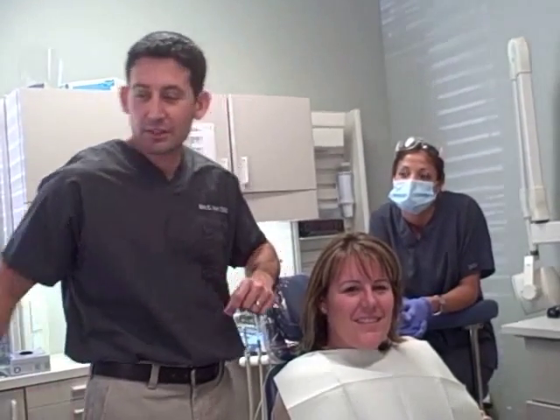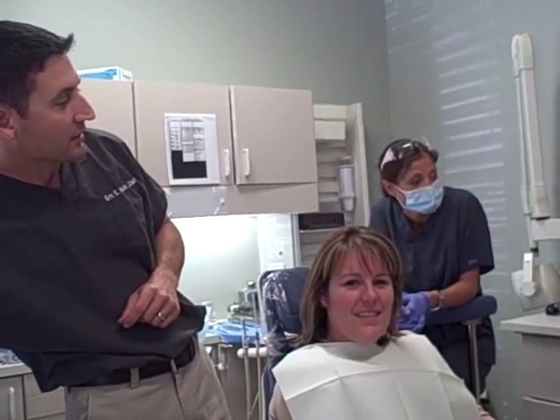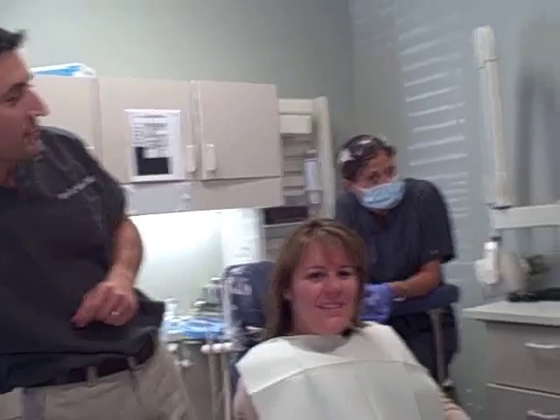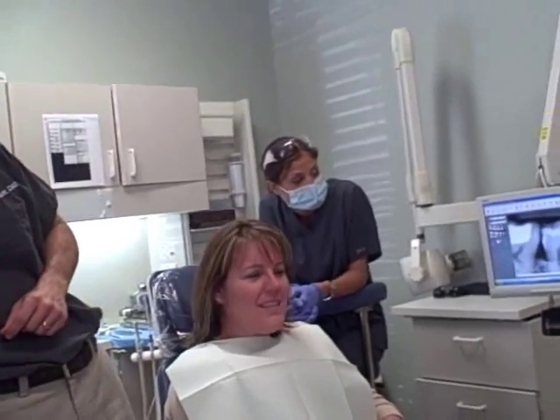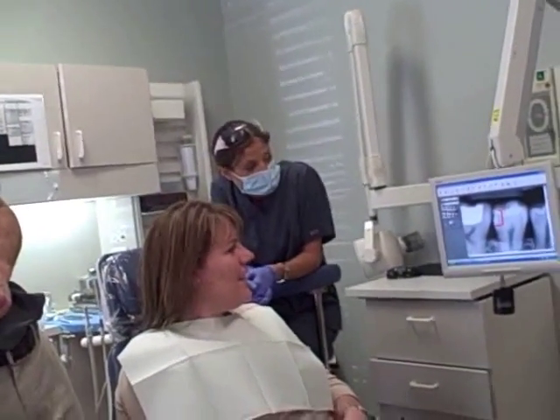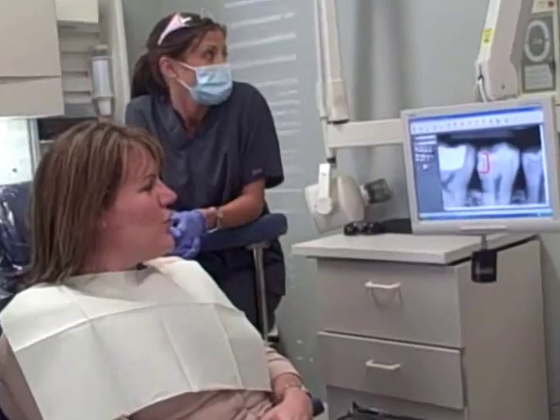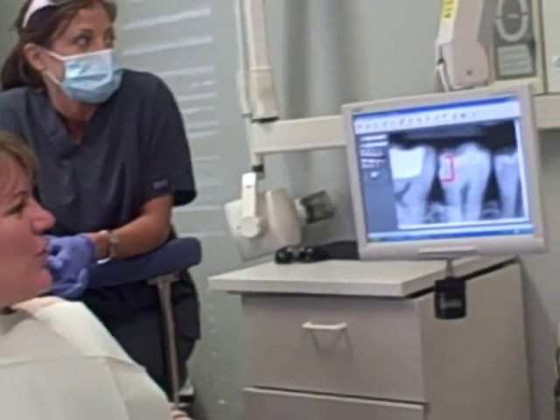Hi, I'm Dr. Eric Moore, DMD. We're here with our patient who's chipped her tooth. We've taken an x-ray, and on the monitor we're able to determine that she's taken a section out of her tooth from a history of chewing ice.